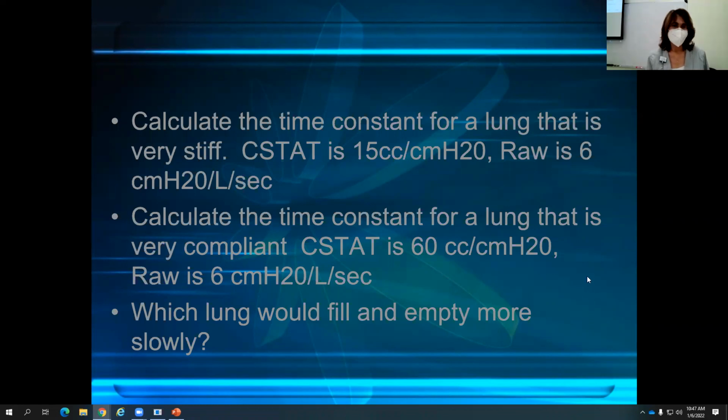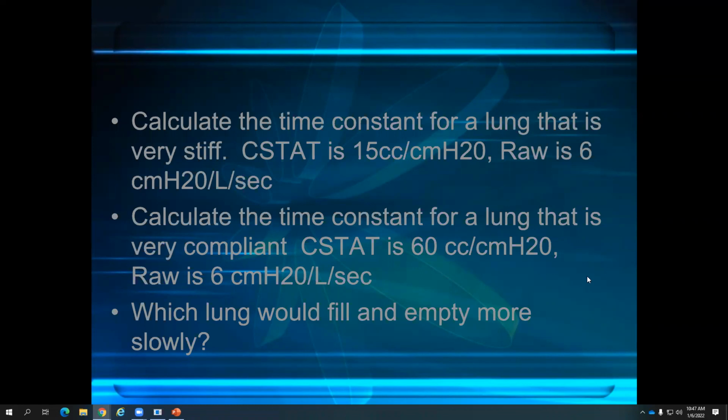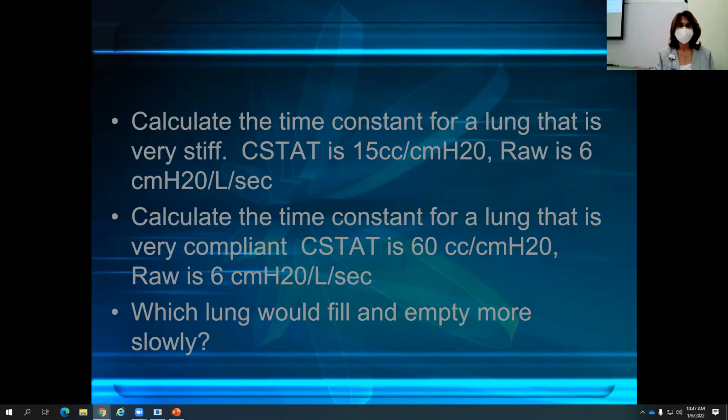Okay, very good. So 0.36 seconds for 1 time constant.